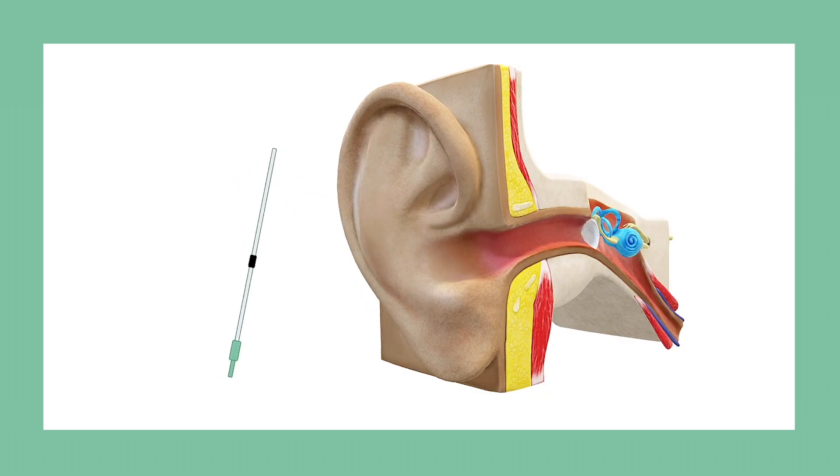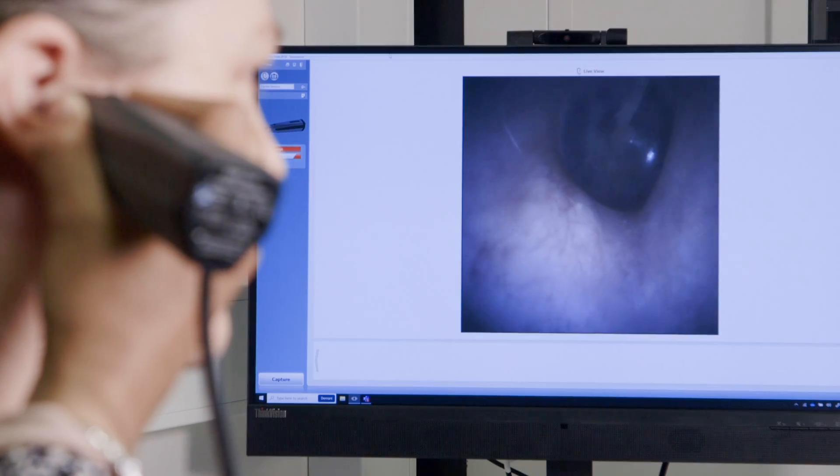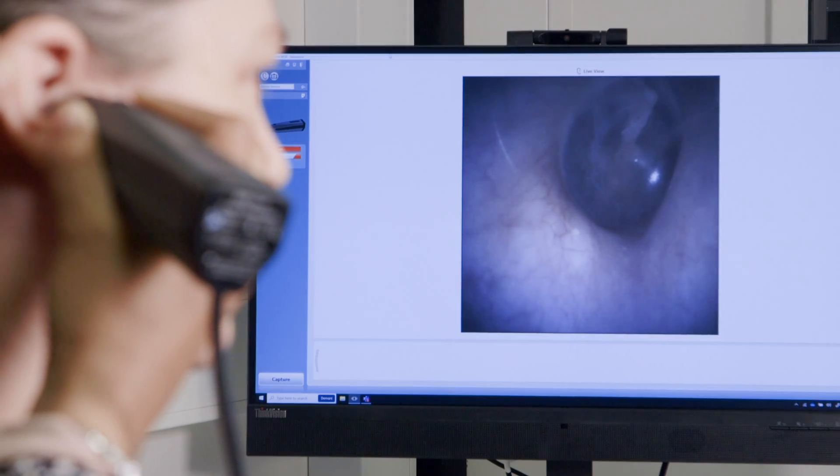The probe tube should be placed within 5 millimeters of the eardrum. By performing otoscopy, you can estimate the length of the ear canal and then determine the depth of the probe tube.